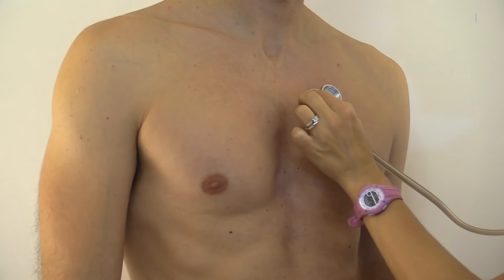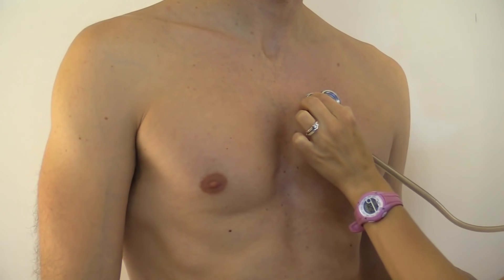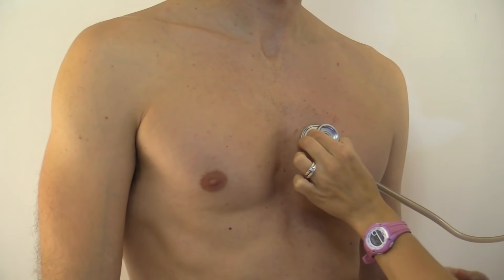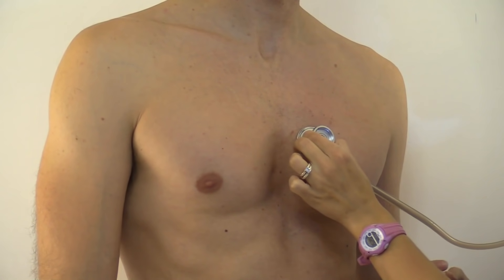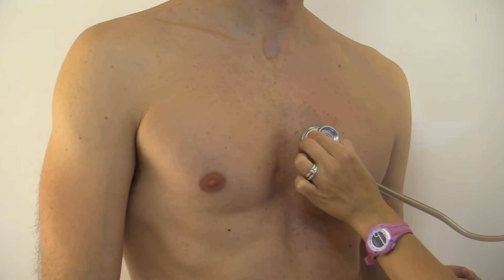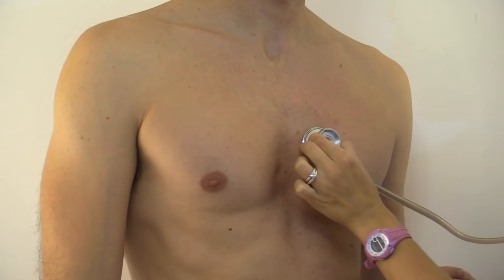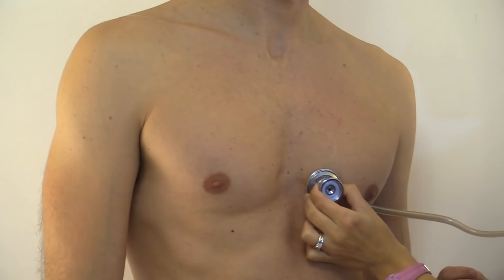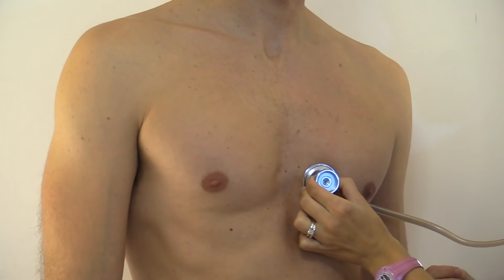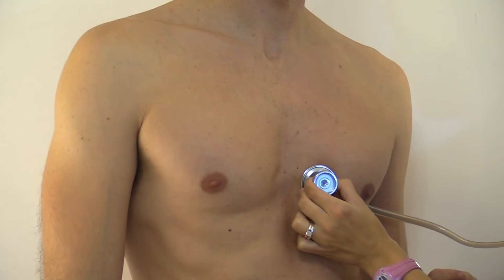Then we're going to go down to the third intercostal space — this is Erb's point. You can hear lub-dub here but there's no specific valve. Then we go down to the fourth intercostal space, which is where the tricuspid valve is, and S1 — the lub — is going to be the loudest at this location.